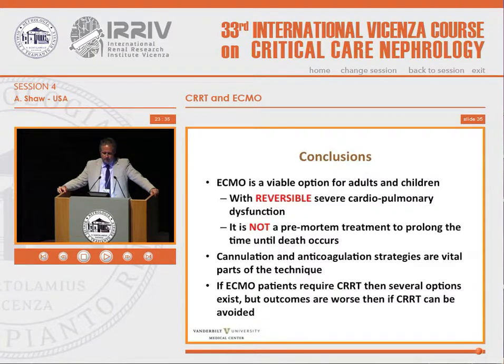And as I've just said, if ECMO patients need RRT, then there are several options, as I tried to point out, but outcomes generally are worse, as is the case with the rest of AKI, that if you can avoid CRRT, then you should.